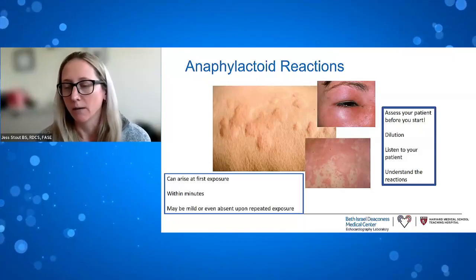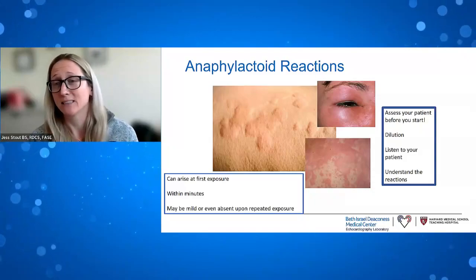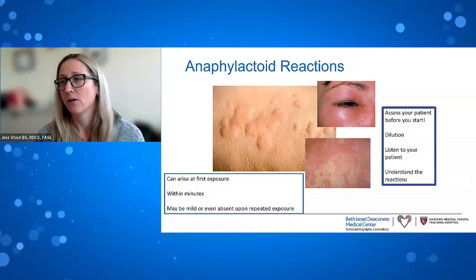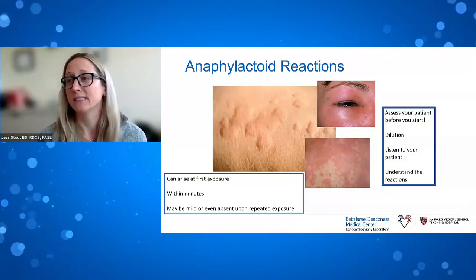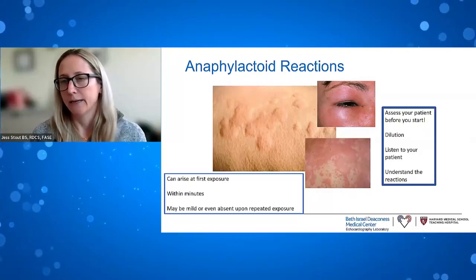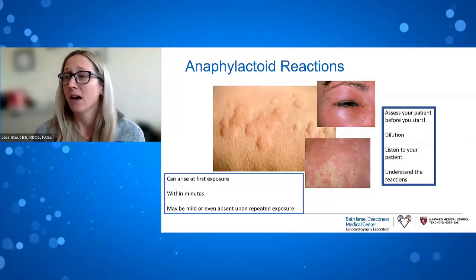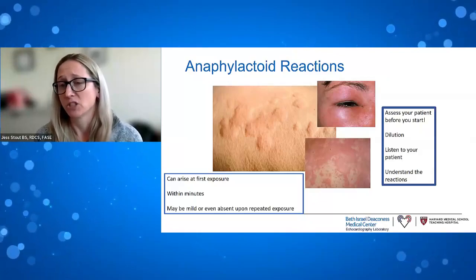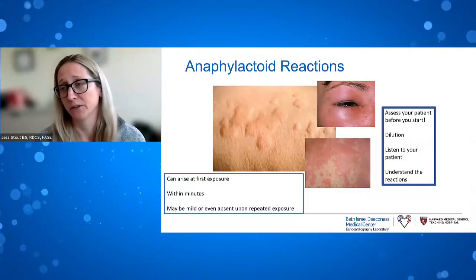So we got the appropriate staff in right away to help handle that. But he knew, and he communicated that to me immediately, and so we were able to address that. So listen to your patient and understand what these reactions look like. Jordy mentioned dilution. I just want to double up on that. The less of something we're giving, the less likely it is to cause a reaction. I tend to dilute 1-to-1, and then I only push a little bit. I assess, make sure everything's good, and then I'll push a little bit more. I don't use much contrast when I'm doing my studies. I don't see the need to use a lot. So in general, I'm diluting and then only using a little bit anyway.